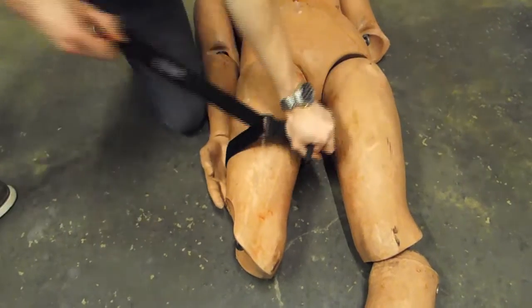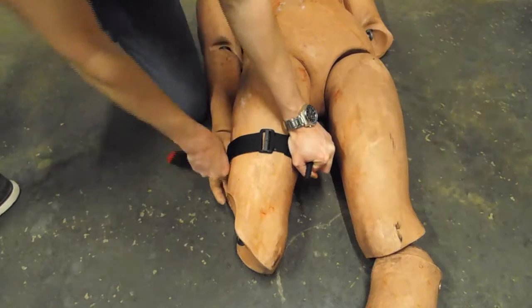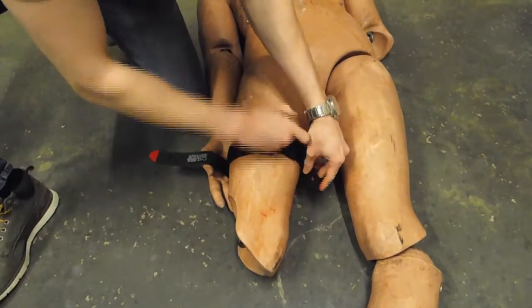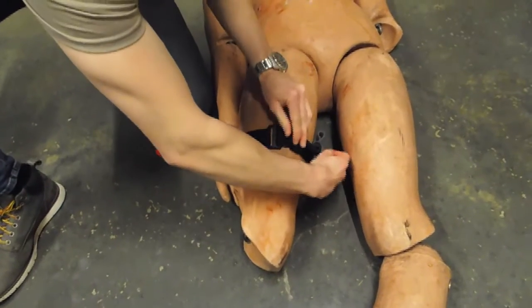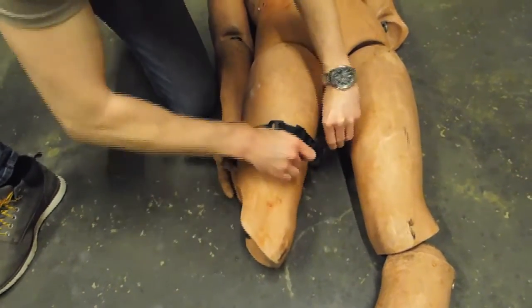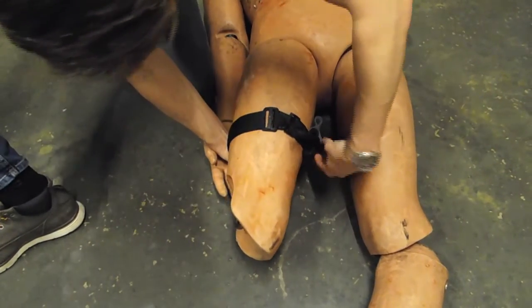Feed the strap through the buckle and fasten the velcro. Now begin to turn the windlass and keep turning until you either see the blood stop flowing out — much like turning off a tap — or you can't turn the windlass anymore. This will be extremely painful for the casualty if applied correctly, but it will save their life.